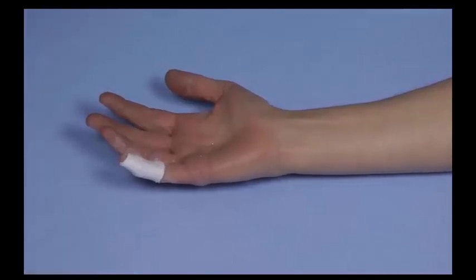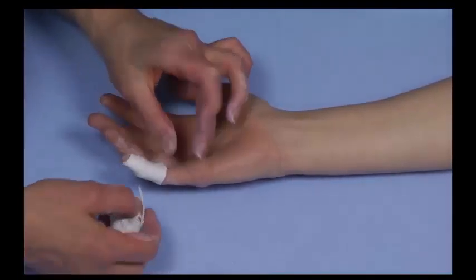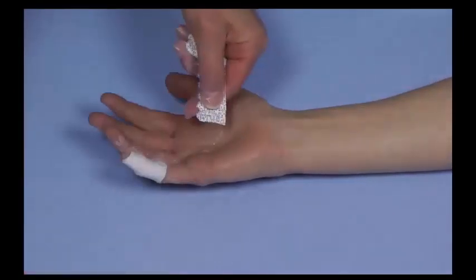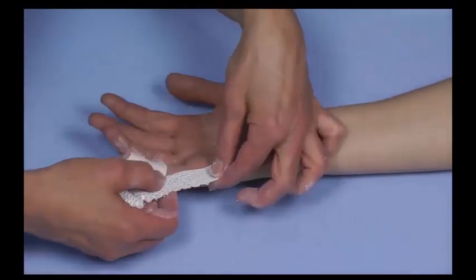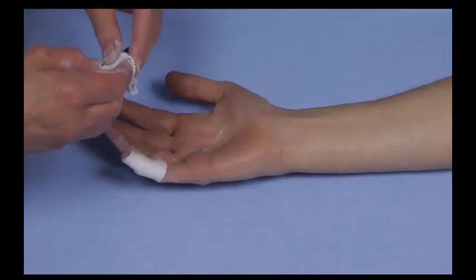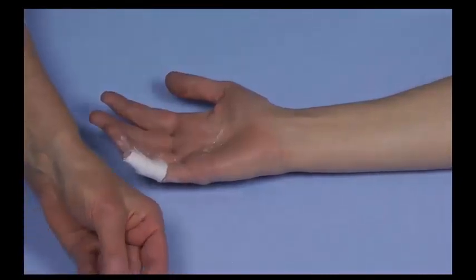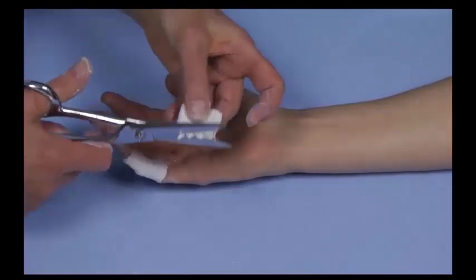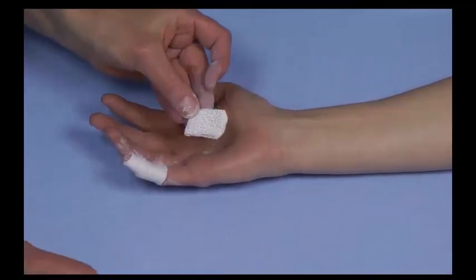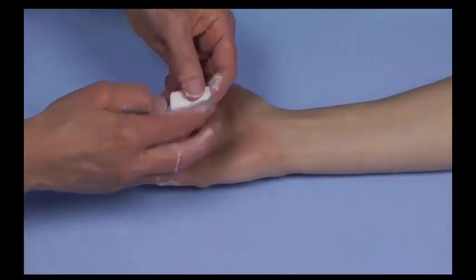While that is hardening, I take another roll and determine the length from the PIP joint to the distal palm — actually fairly short. I square that off and fold it two, three, four, five, six layers. I square off the ragged edges and cut the corner off the bottom. I dip it in the water and after dipping I smooth it out.